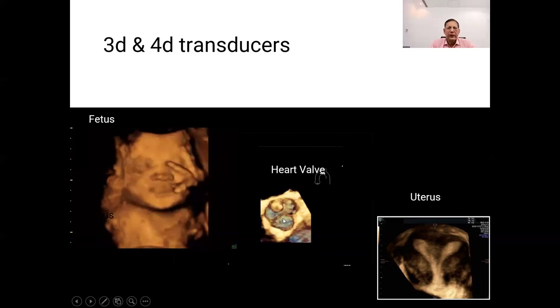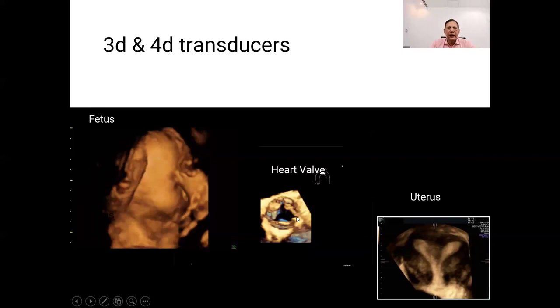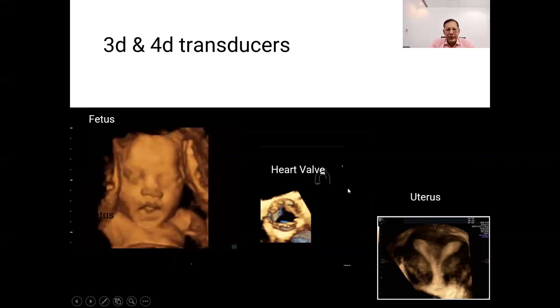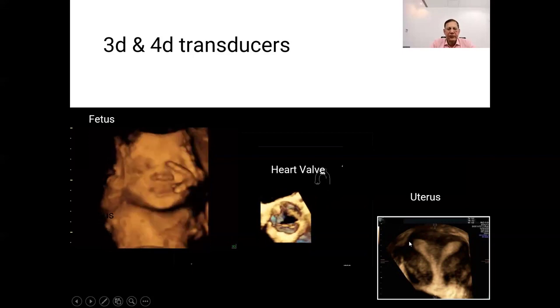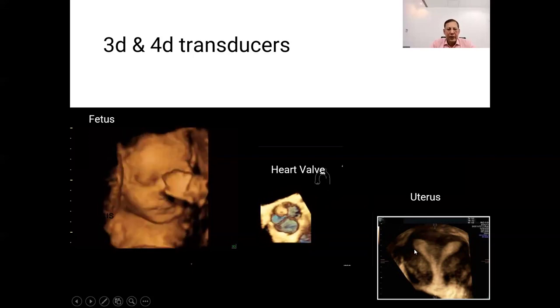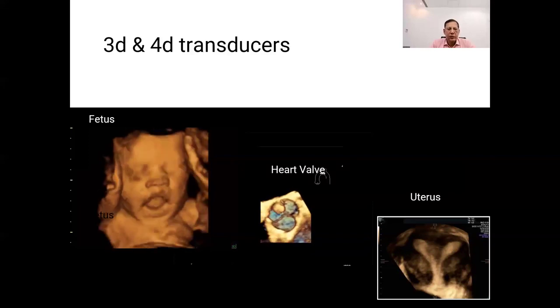Another great application is in cardiology, where these help in visualizing the structure of the heart and identifying congenital heart defects. They are also used in gynecology and urology for detailed examination of pelvic organs, including the uterus, ovaries, and prostate.